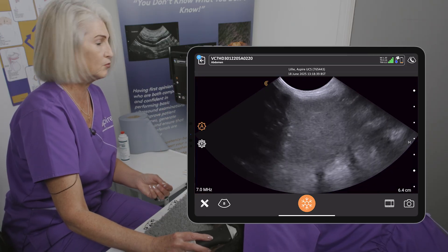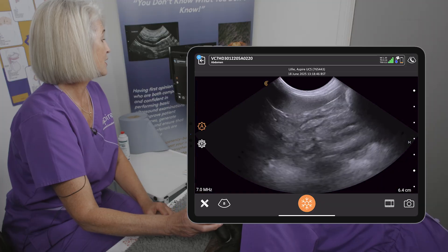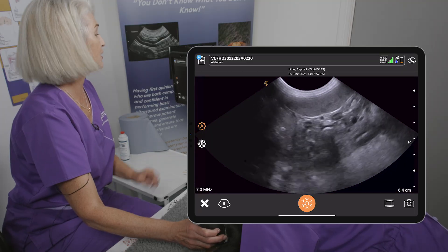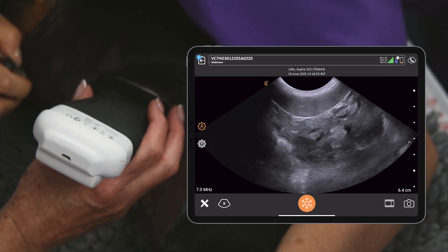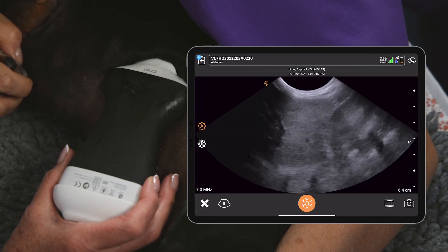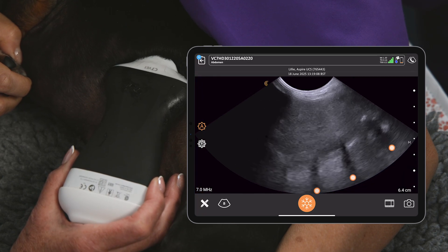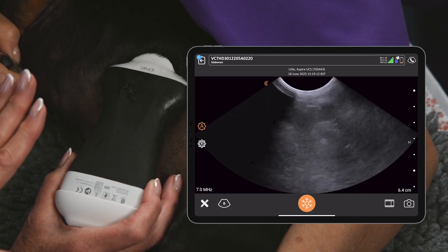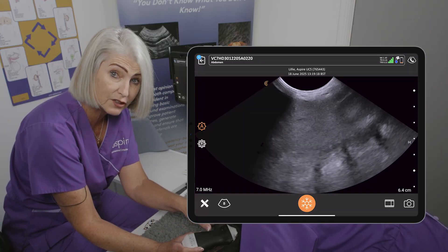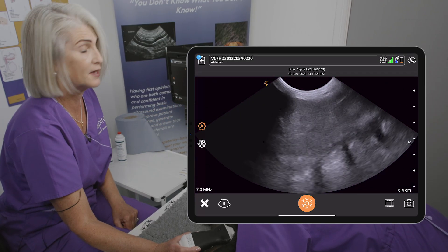When looking at the spleen, it should be slightly finer and brighter in echo texture than normal liver. The capsular margin should be nice and straight, like the hepatic capsules. The body of the spleen takes on a kind of ellipsoid shape. I always take an image of the head of the spleen to prove I didn't miss it. These lovely 'shark's teeth' pattern here — the posterior acoustic shadowing — is from the rib shadow, because the scan plane is catching those ribs on the other side of the spleen.